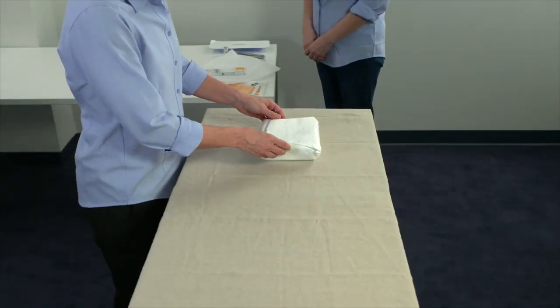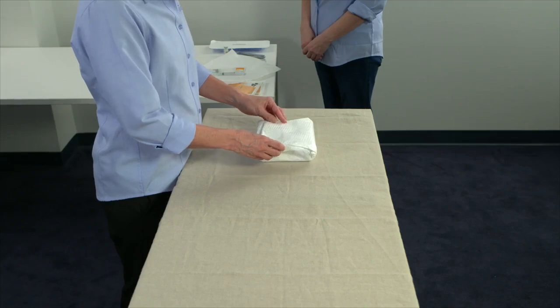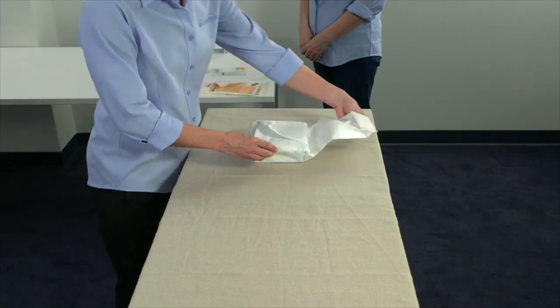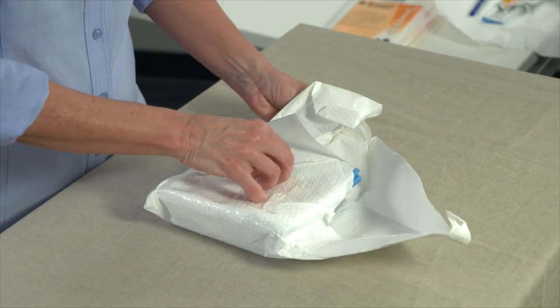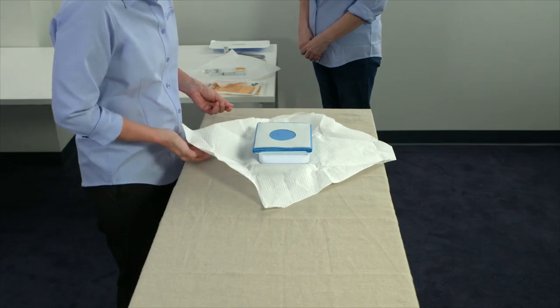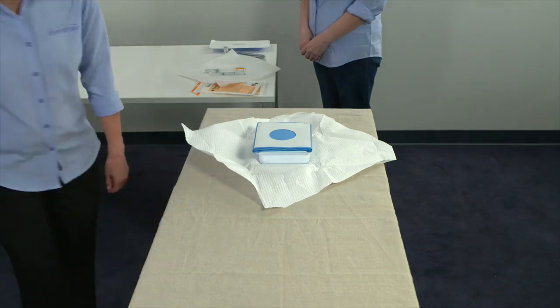Now it's time to open the larger kit package on the clean, flat surface you designated as the sterile field. Position the kit so that the outer flap faces up and toward you. Then pinch open the outer cover away from you. Open the two sides next. Then, open the last flap toward you. Remember, everything inside, including the inside of the drape, is sterile.